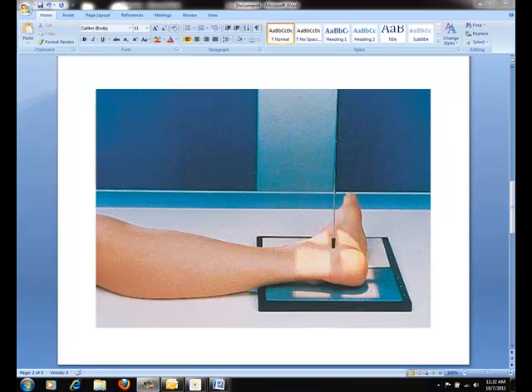Adjust the IR so that the long axis is parallel with the plantar surface of the heel. After dorsiflexion has been performed, direct the central ray perpendicular to the calcaneus. Center about 1 inch distal to the medial malleolus. This places the central ray at the subtalar joint. For collimation, adjust 1 inch past the posterior and inferior shadow of the heel. Be sure to include the medial malleolus and the base of the fifth metatarsal.